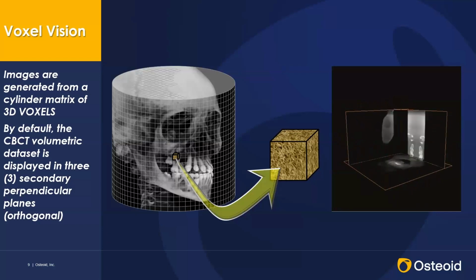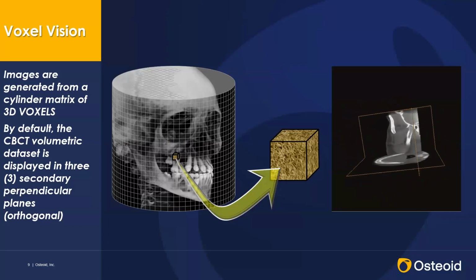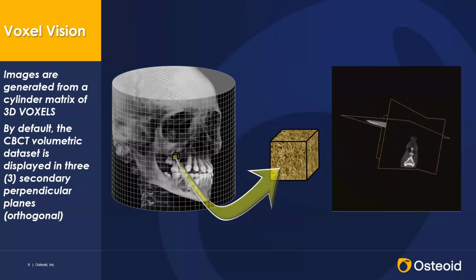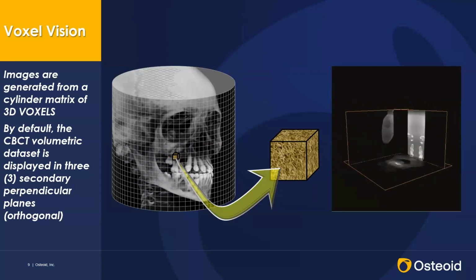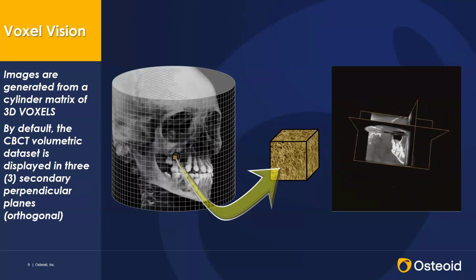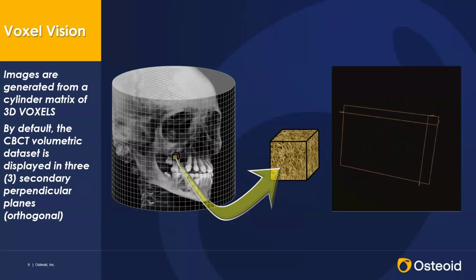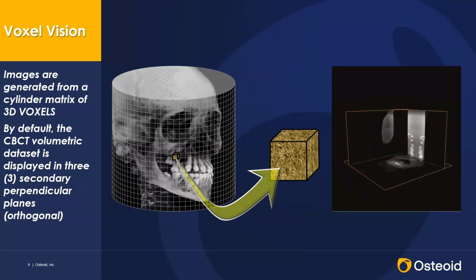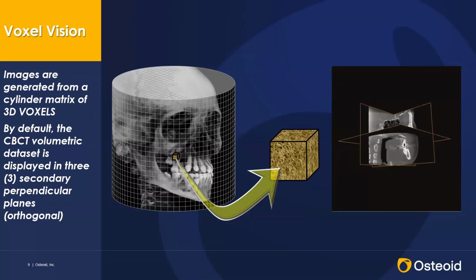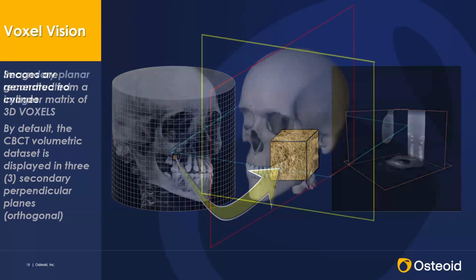In medical imaging, orthogonality is important and the principal method by which images are reviewed. In dentistry, it's not the principal way in which we review images. We usually reorientate the data to the specific anatomic part that we're interested in. In today's presentation, that will be obviously the tooth. If this was temporomandibular joint, we would reorientate the cone beam data set to be perpendicular to the TMJ.